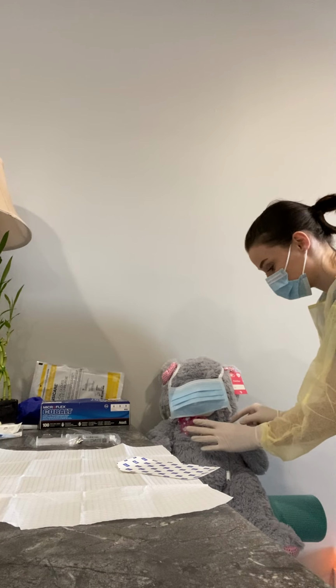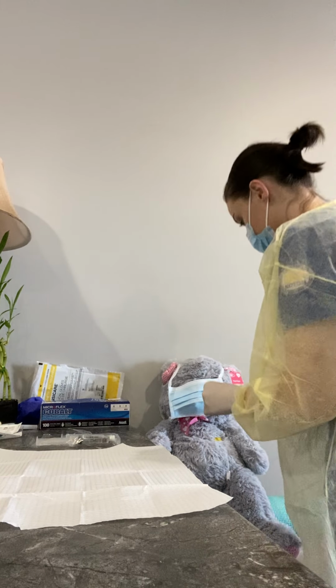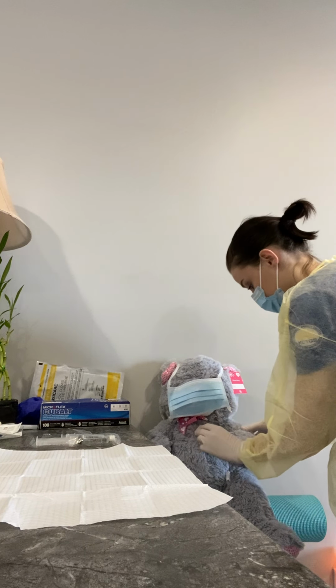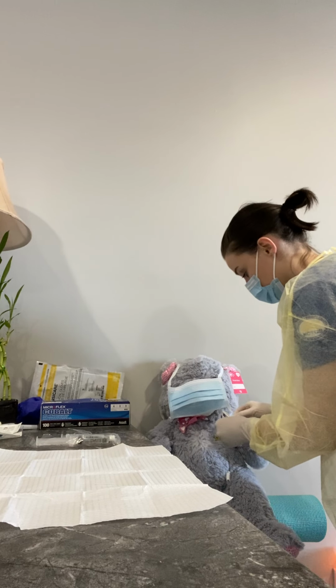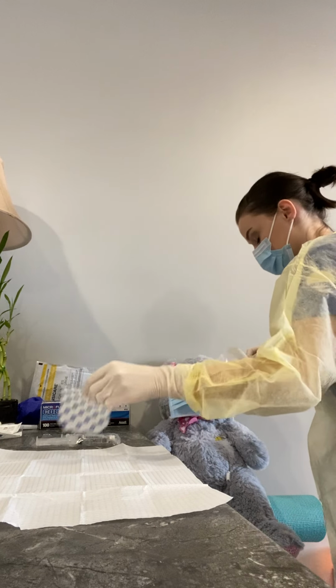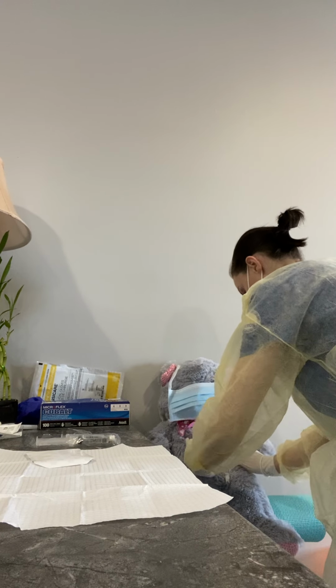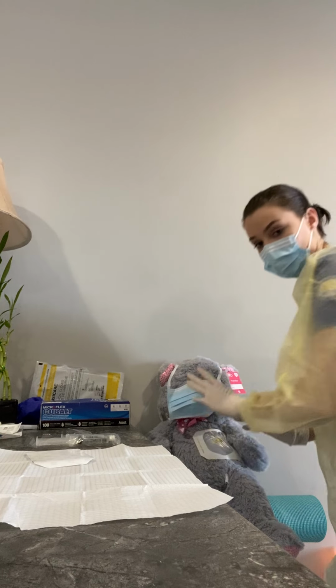So I've got that inserted, and then I'm going to immediately place my Tegaderm on top. Just like that. And you know what? I may just make life a little easier. Okay, so we've got that placed. Now my sterile part is over.